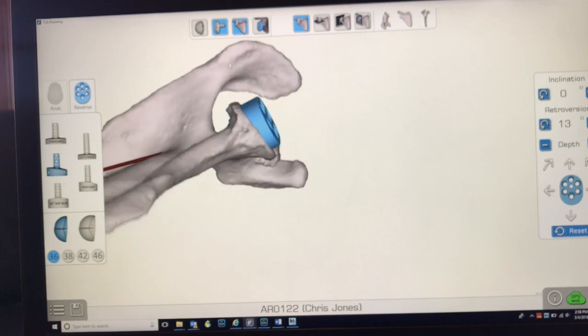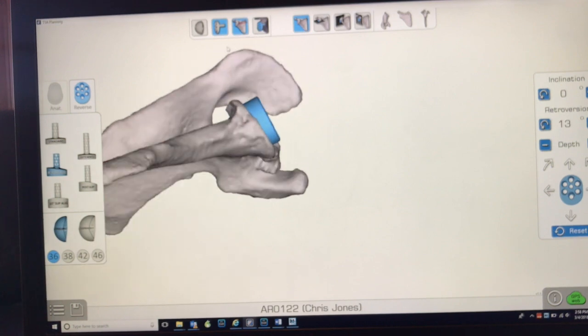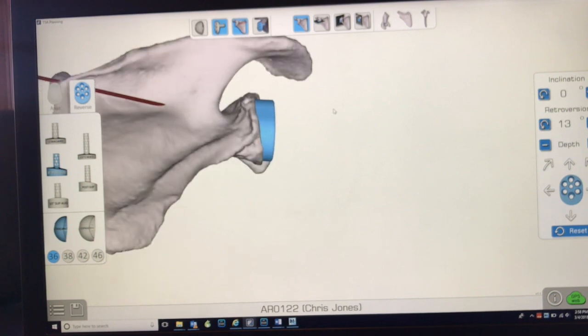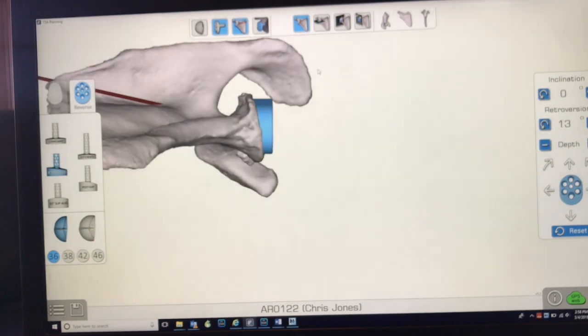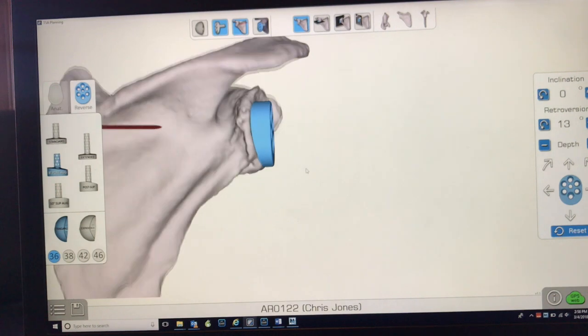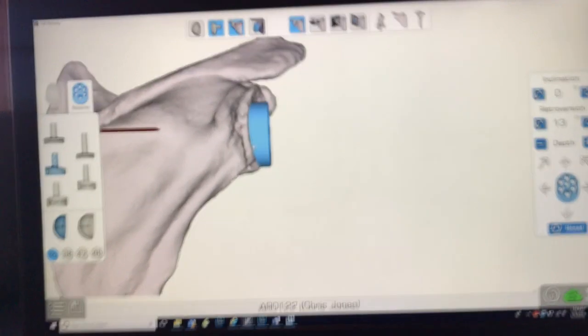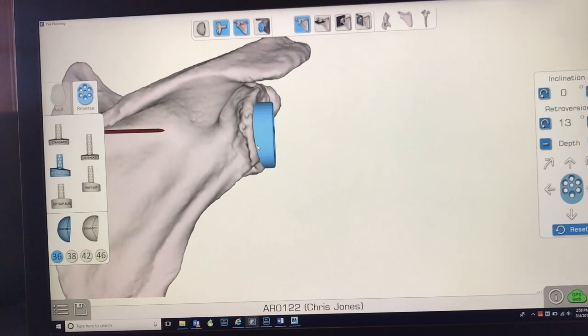But because you have screw fixation of this, as opposed to just relying on press fit or cement with the standard prosthesis, you don't have to have absolute 100% support because you get such solid and rigid fixation. Anyways, really exciting. This really changes things with shoulder replacement.